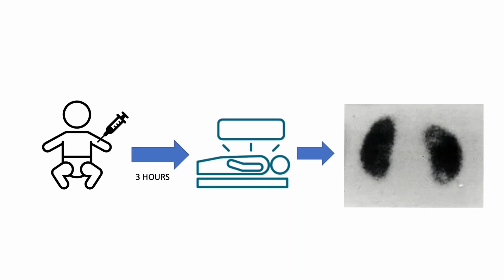After injecting the radiopharmaceutical, imaging is generally done after 2 to 3 hours to allow for the relatively slow background clearance.